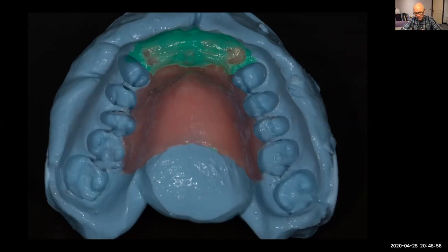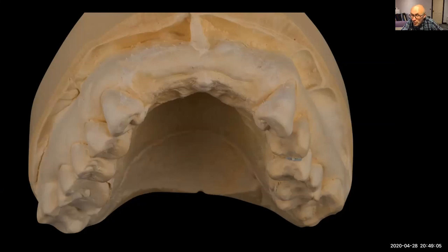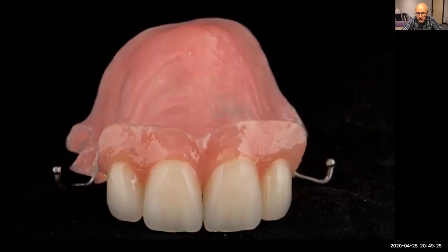And then he gives it back to me at the end of the day, once he's relined it. So he relines that. He pours a lovely model in this. Superb. And then relines that flange and makes this denture future proof until we can do the definitive. But look at it, it's way better. And this flange starts to help with the retention too. It's really good. So that's the immediate there.